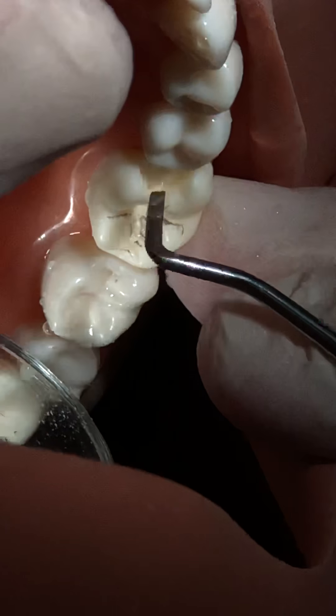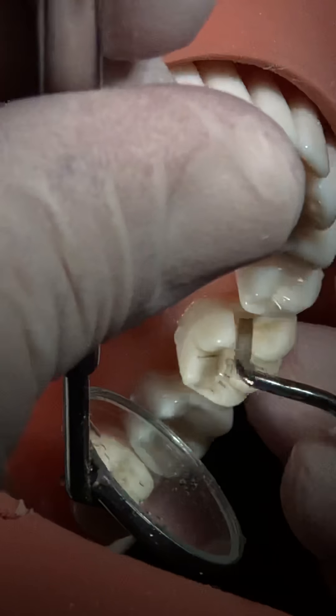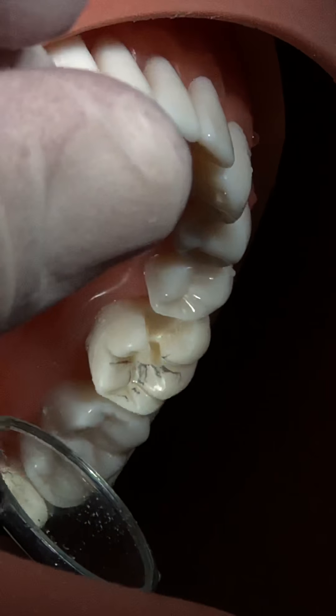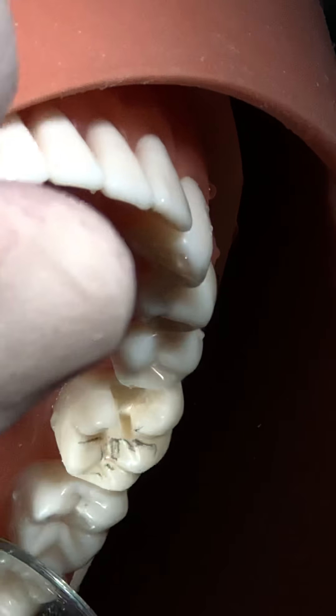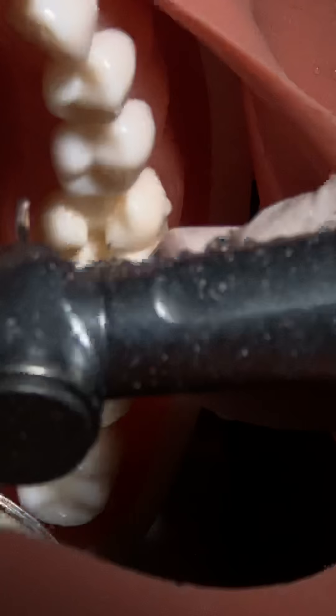When it becomes smaller it is just removed. The depth should remain the same - there should be no step. When you remove the contact area and the contact is removed, you will smooth it out - remove any undermined enamel.